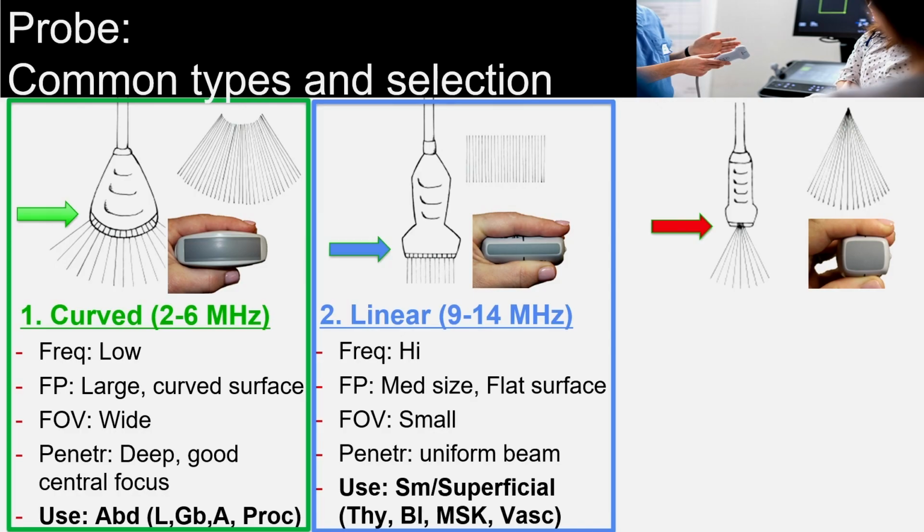Very useful for superficial and small pathologies such as skin, thyroid, urinary bladder, or looking at muscle or tendons, musculoskeletal, and certain superficial vessels like a DVT study.